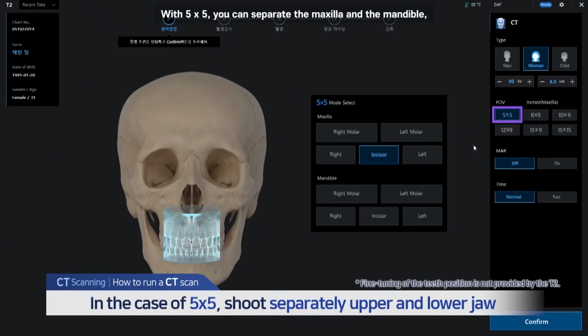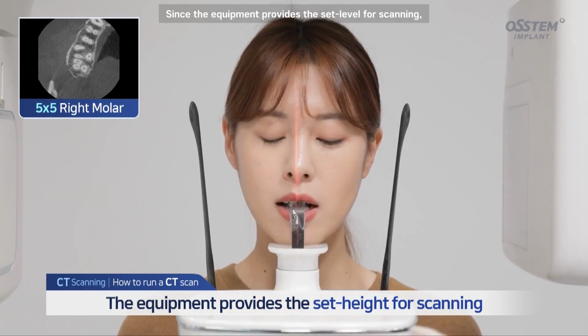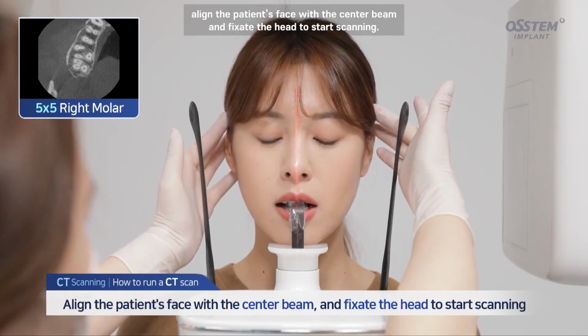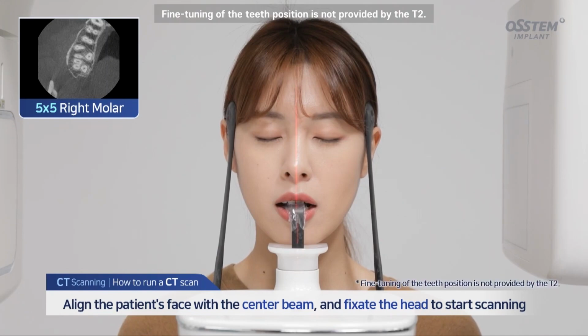With 5x5, you can separate the maxilla and the mandible, and choose one of the 5 points for scanning. Since the equipment provides the set level for scanning, align the patient's face with the center beam, and fixate the head to start scanning. Fine-tuning of the teeth position is not provided by the T2.